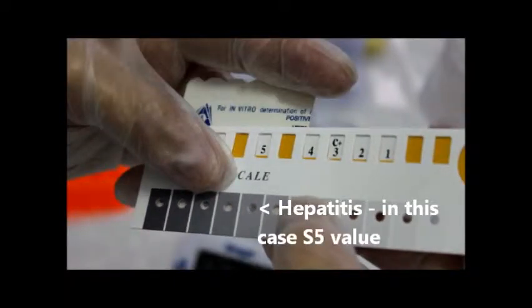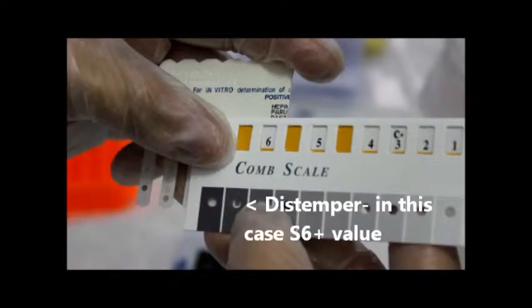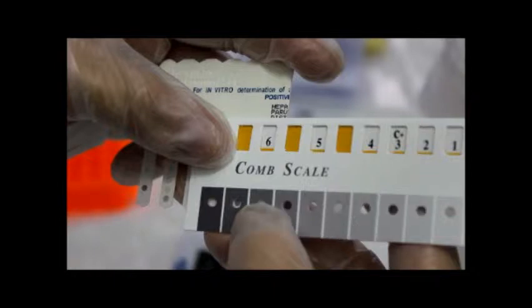The upper middle spot on the comb gives a result of canine hepatitis IgG antibodies in the specimen. The lower middle spot on the comb gives a result of canine parvovirus IgG antibodies in the specimen. The bottom spot on the comb gives the results of canine distemper IgG antibodies in the specimen. Remember, these colours and these tests are specific for the VaxiCheck.